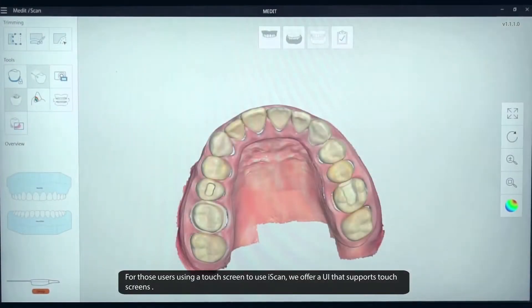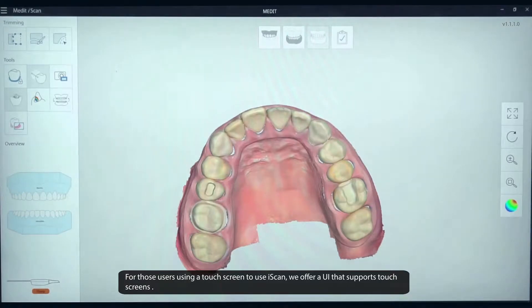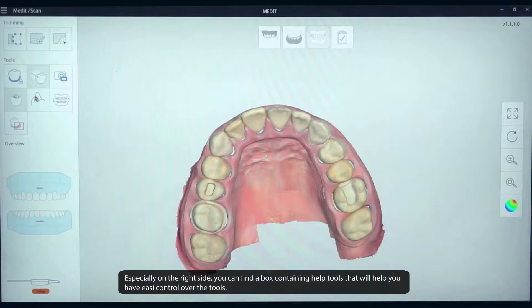For those users using a touchscreen with iScan, we offer a UI that supports touchscreens. Especially on the right side, you can find the box containing help tools that will help you have easy control over the tools.